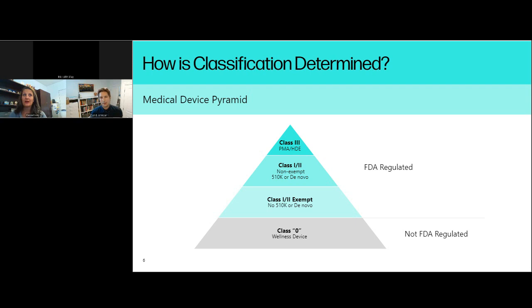Sure. From a fundamental standpoint, the substantial equivalence bar for any type of device doesn't matter from the FDA standpoint if it's additive or subtractive manufactured. The difference comes in historically, the way that the FDA looks at it is if you have a family of products, for instance trauma screws, with different diameters and different lengths. If the product development engineer identifies the geometry that represents worst case for that family, then that's the only size we need to test to show that it's met the bar of substantial equivalence.